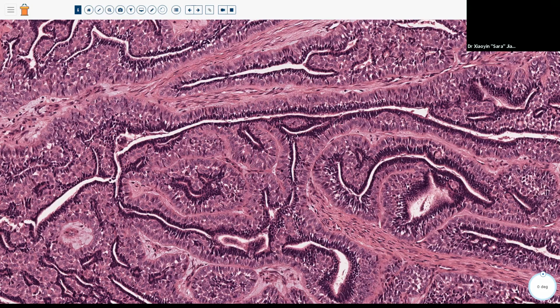And it's just really kind of pretty in this one. But I think that just kind of stepping back for a minute to talk about IHCs, the pattern of staining is really, really informative, not just whether the stain is positive or negative. So you have to do a little bit more thinking. IHC, I think when you're a resident, sometimes it's just like, oh, is it brown or not, like positive or negative? But unfortunately, nothing in life or pathology is really that simple. And especially in salivary glands, nothing is really that simple. And you really have to kind of figure out what your IHCs are staining, not just whether it's staining or not.